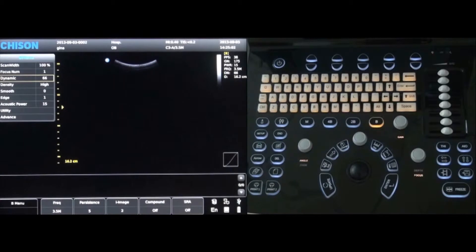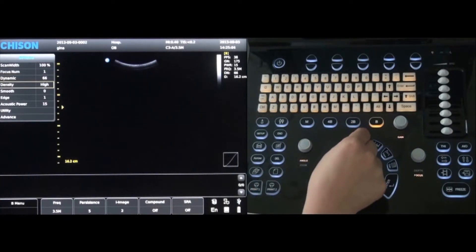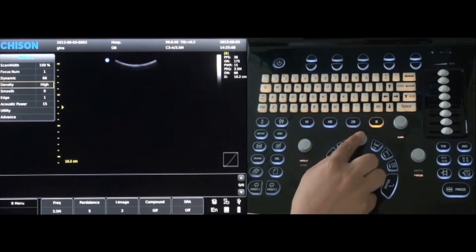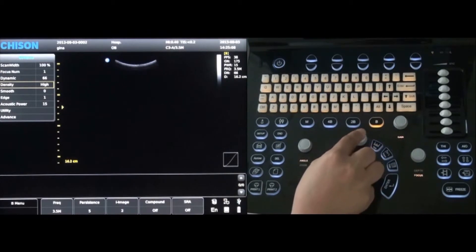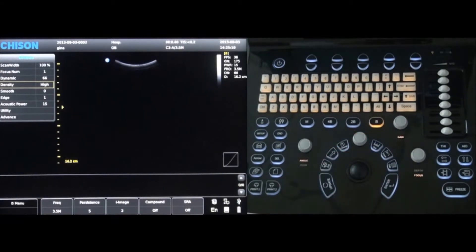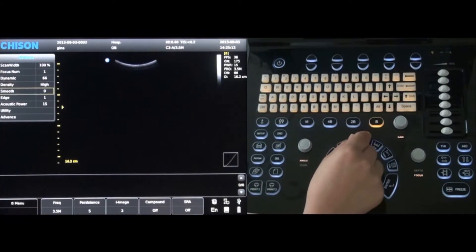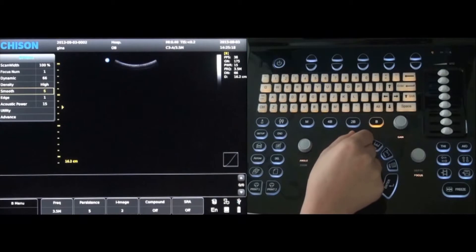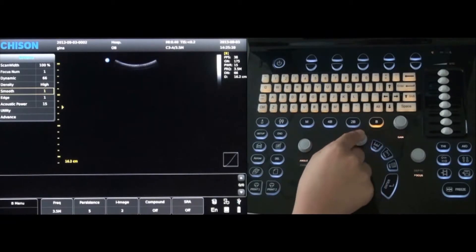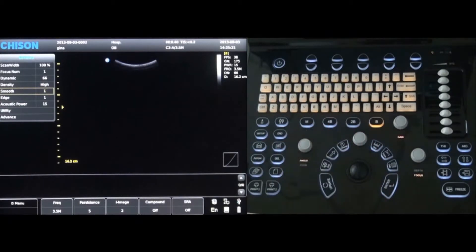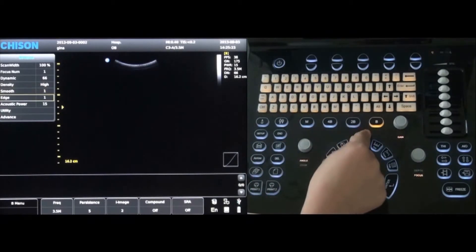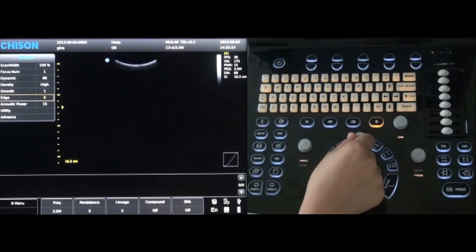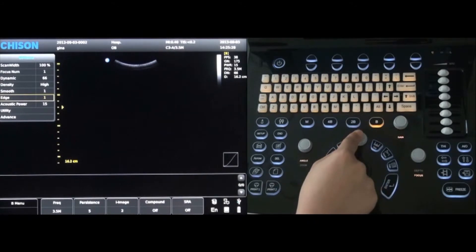Density can be changed to high or low by rotating the menu key; however, high density is recommended. Next is the smooth option — different levels can be selected by rotating the menu key. The edge option is controlled in the same way: select it and rotate to the desired level.